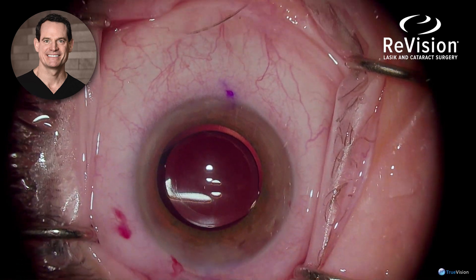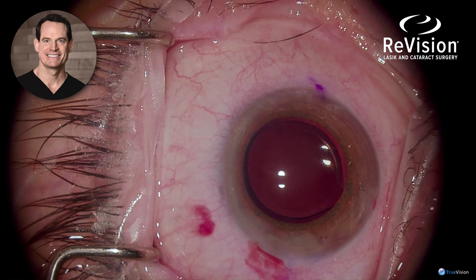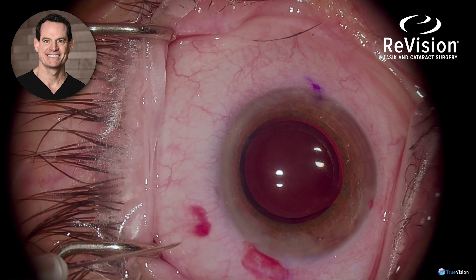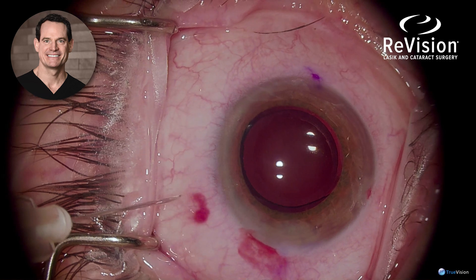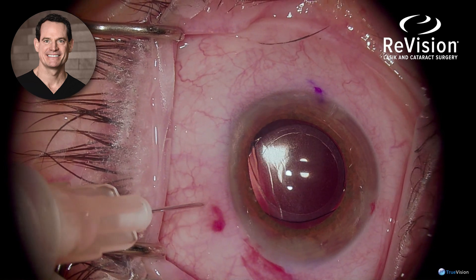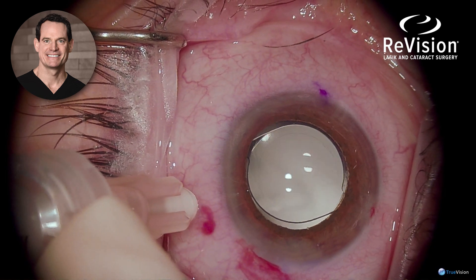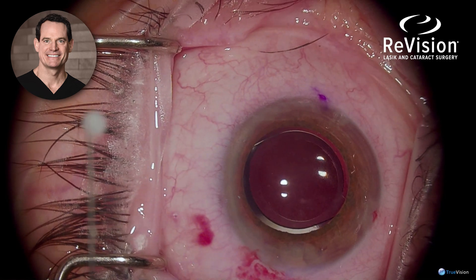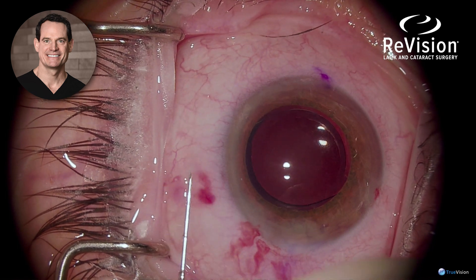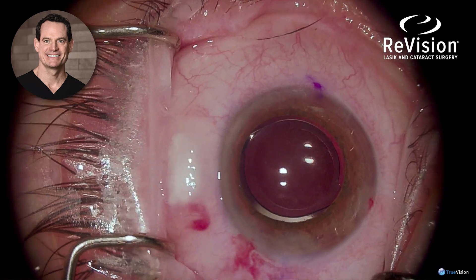3.5 millimeters measured back by a caliper marks the injection site through the pars plana for the Trimoxy — a Triamcinolone and Moxifloxacin combination medicine — which is introduced into the vitreous for better prophylaxis against infection. For further antibiotic penetration, we also use a subconjunctival Trimoxy.